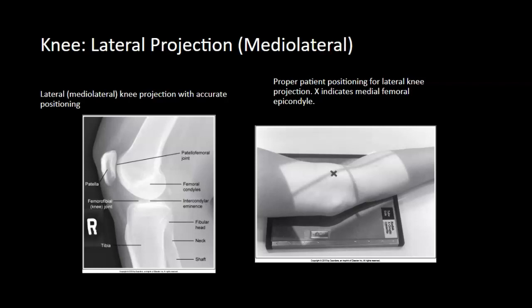The knee joint space should be open. The anterior and posterior margins of the medial and lateral femoral condyles are aligned and superimposed. The tibia superimposes 1/2 of the fibular head. The knee joint is at the center of the exposure field. 1/4 of the distal femur and proximal lower leg and the surrounding knee soft tissue are all included within the exposure field.